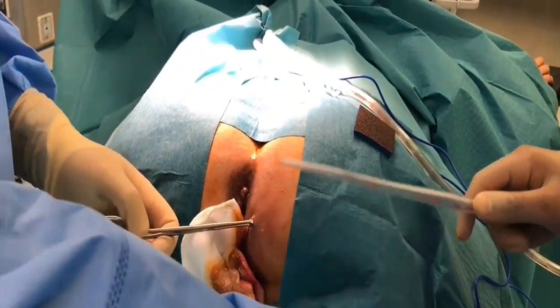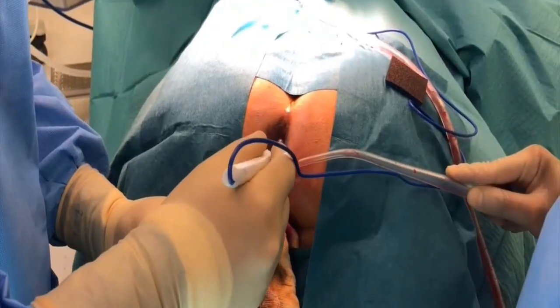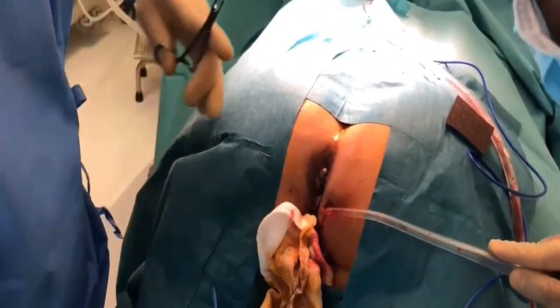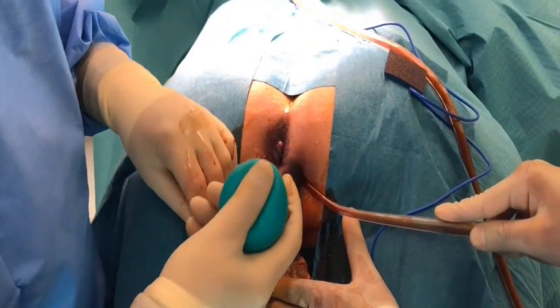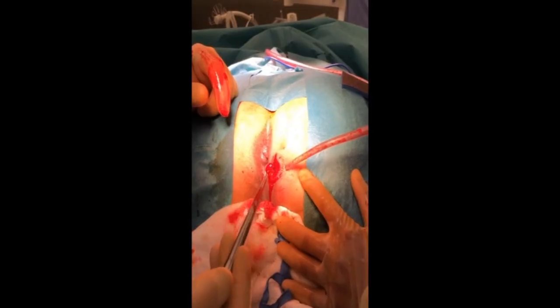Excise the skin flaps of the cruciate incision. Irrigate again. And do the proper curettage.